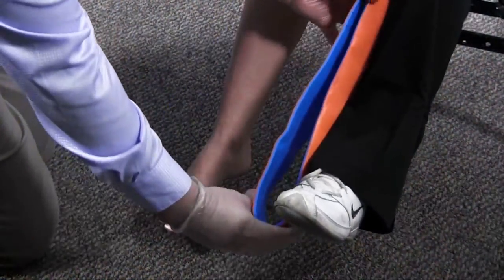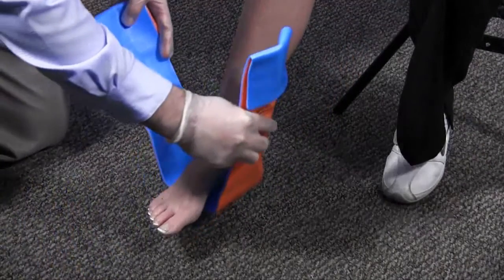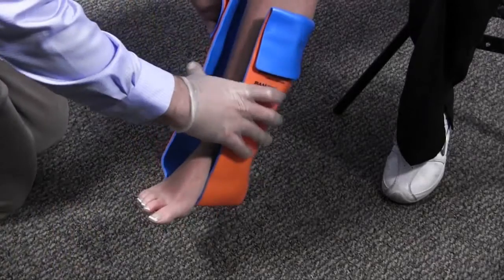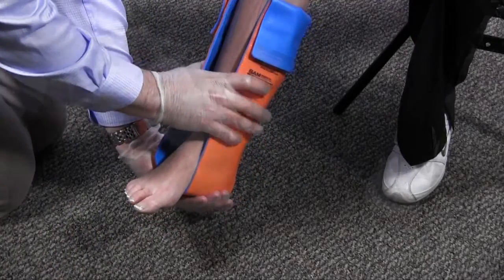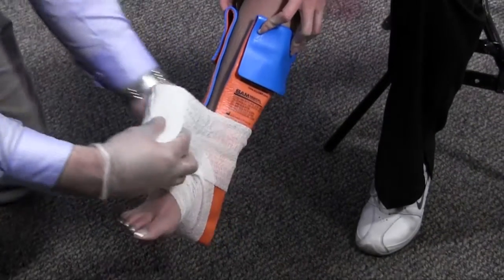Once I am certain motor, sensory, and circulatory functions are present and normal, I will select the appropriate materials or device to immobilize the injury. Now that I have all my materials ready, I will properly immobilize the injury. I will apply the appropriate material to the bones above and below the site of injury to ensure adequate immobilization.